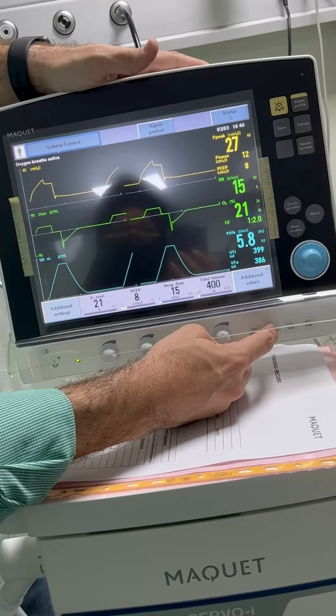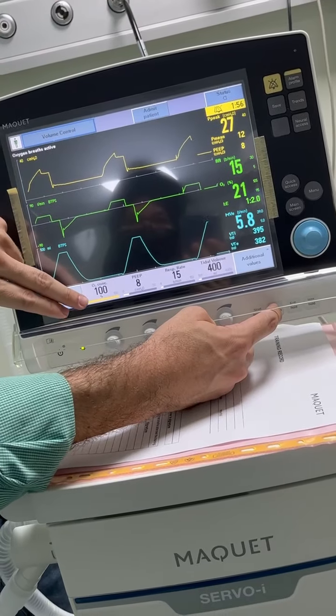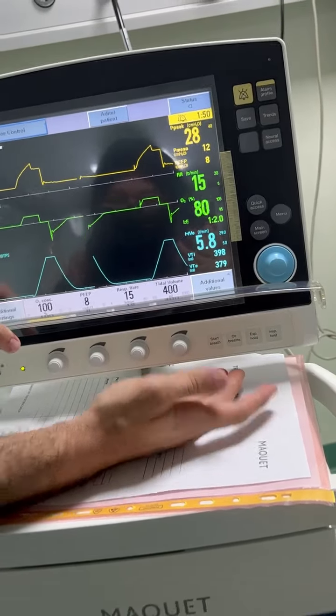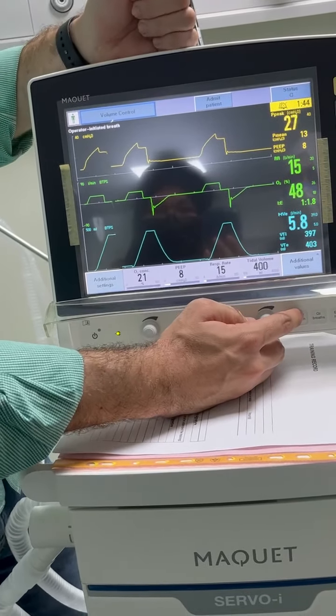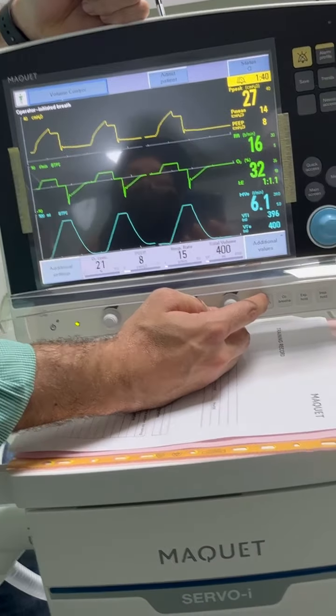It's like an ambu bag. It will increase to 100%. Just press. Ah, okay. What is this start breath? Start the breath, ambu bag. When you click on this one, it will give an extra breath, like a manual breath, like ambu bagging. You need to press once only. How will I know? When you click, you start the breath.